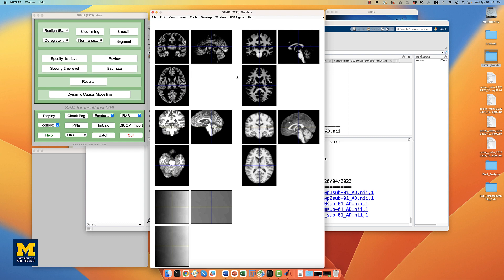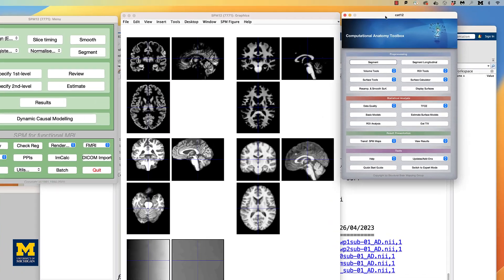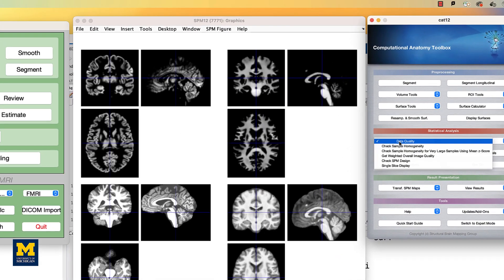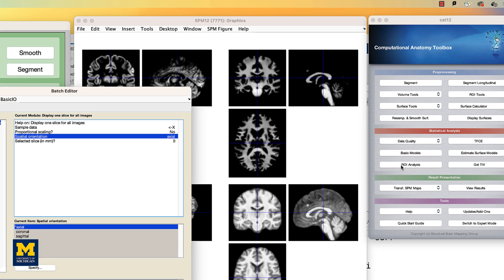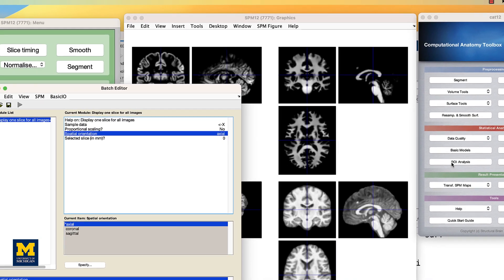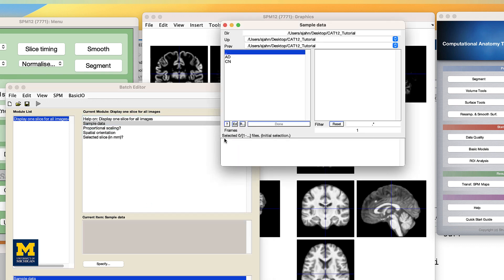To quickly check whether the normalization was successful for all the images, from the CAT12 GUI, we're going to click on the data quality drop-down menu, and select single slice display. This will open a new batch editor window, from which you can select all of the images, starting with MWP1, or the gray matter segmentation images.